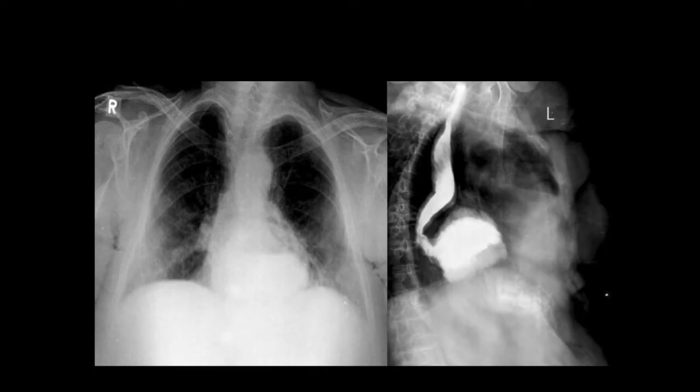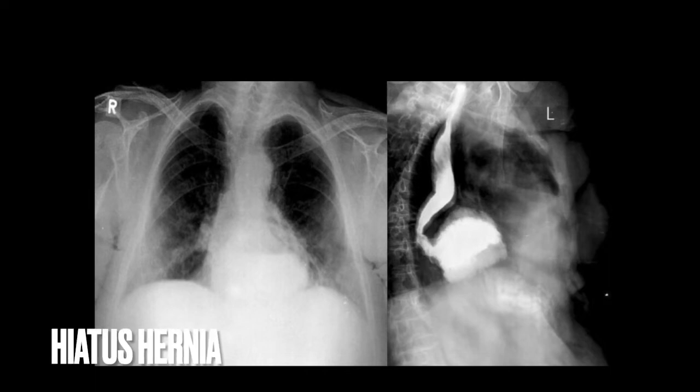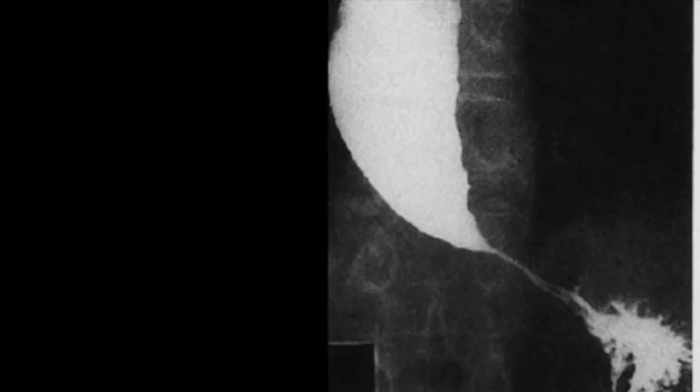The next case shows two films: a chest PA view and a barium study. In the oblique or near-lateral view, you can see a large hiatus hernia occupying the retrocardiac space filled with barium. This is sometimes also seen as a spot film showing an air-fluid level in the retrocardiac space.